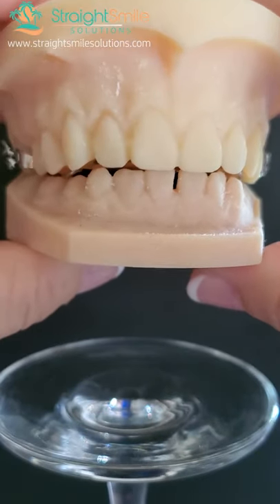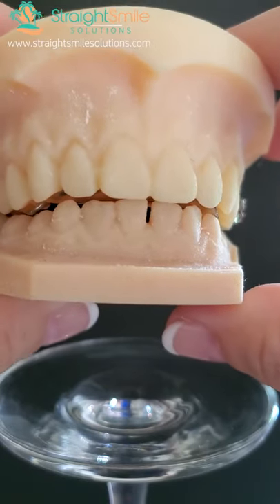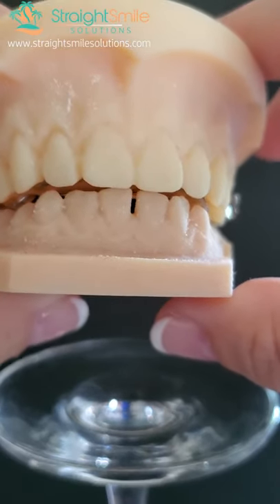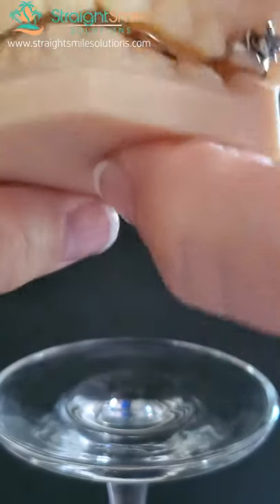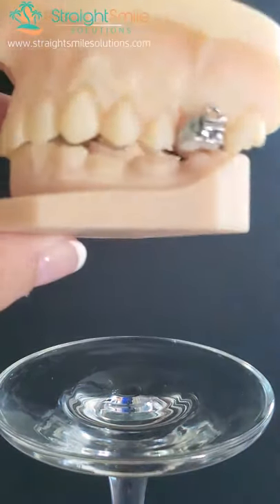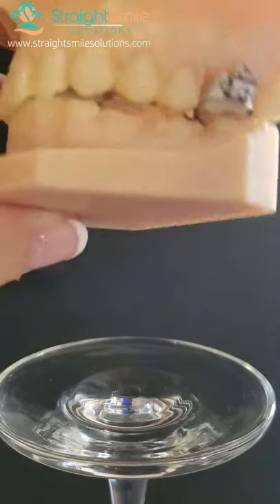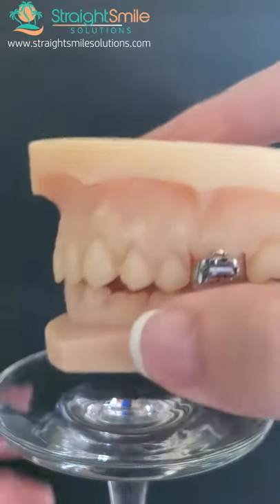So now let's see what it looks like once we put the appliance in, so you can see the difference. Holy cow! So if you had lower brackets on — we don't even have to put those junk bite bumps on the back. This will naturally allow the curve of Spee to level out, whether you have braces or not. If you have braces on, it happens even faster because you can run some box elastics.